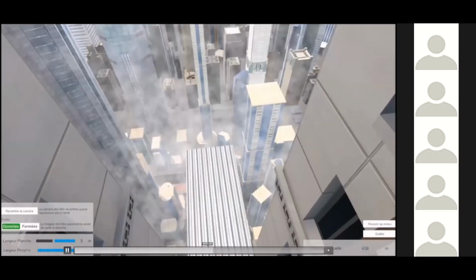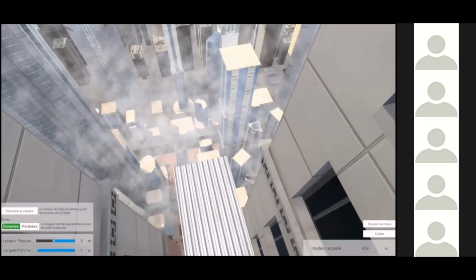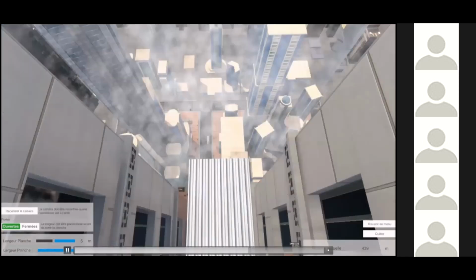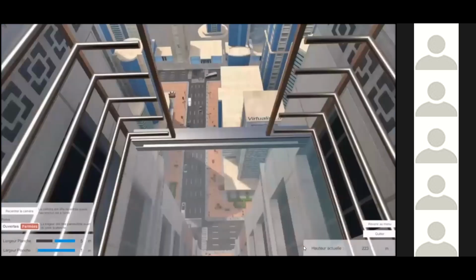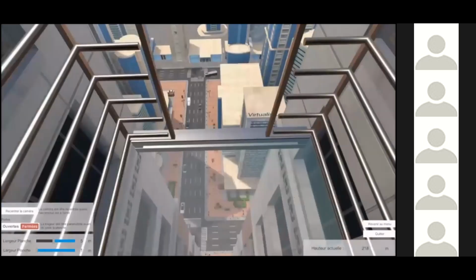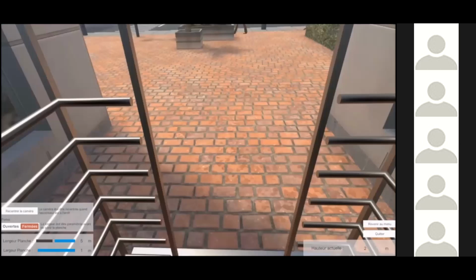We can set the size of the plank, so it can be easier. Of course, usually with patients, I start at maybe 2 meters high and not more. So that would be maybe the last session of rehabilitation. And at the end, when it's slowing down, you actually feel this stomach reaction. So you feel the actual movements even if you're not moving.